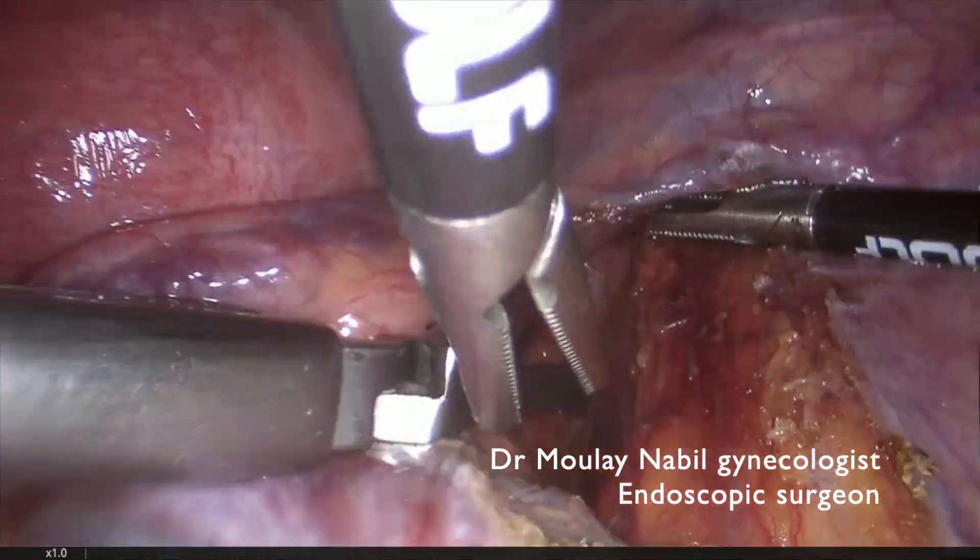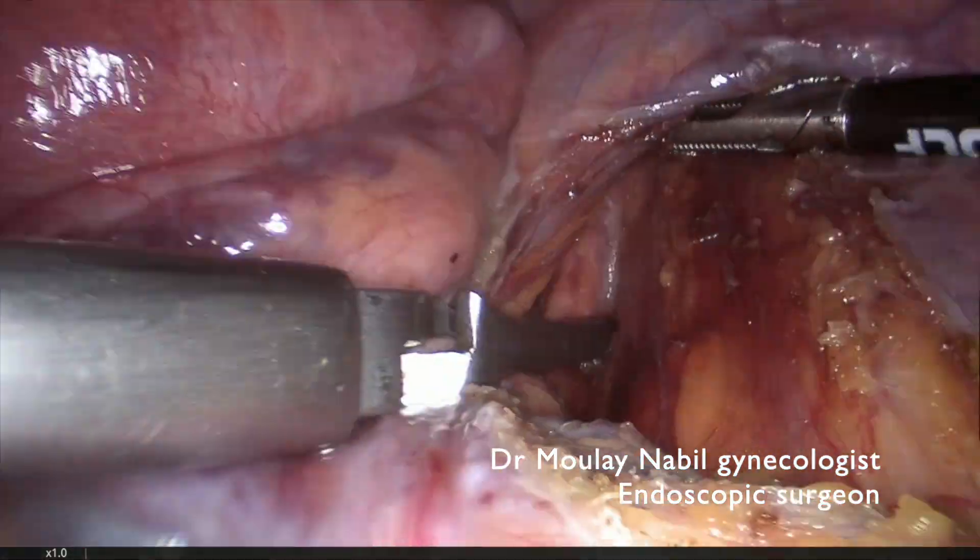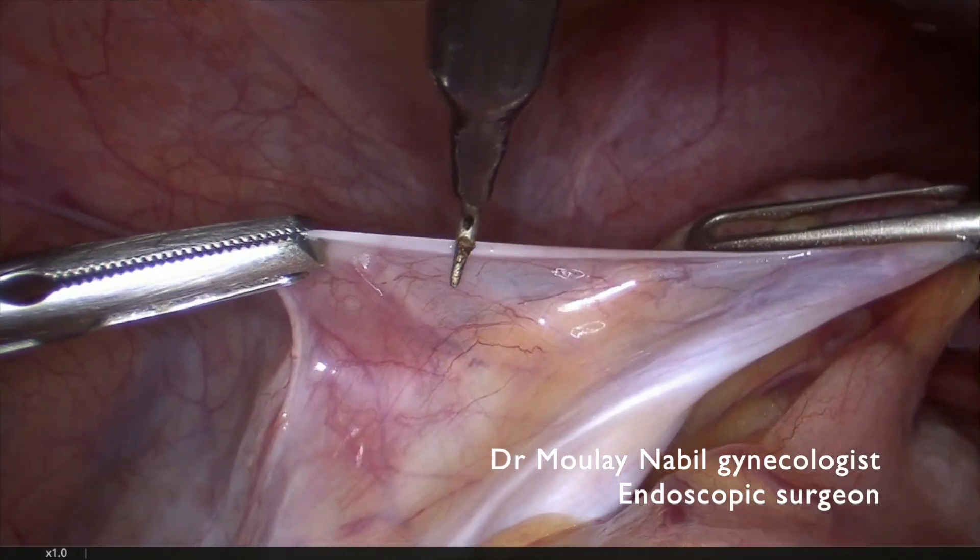We can safely place a bulldog on this artery — it's a 10 millimeter vascular bulldog clamp.